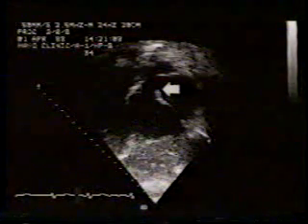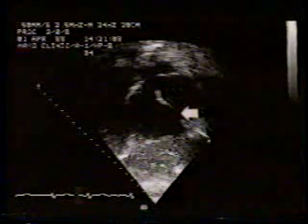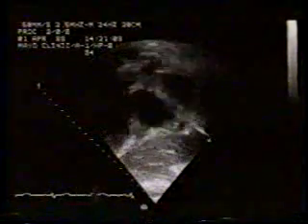We are looking at the crest of the atrial septum. Note clear visualization of this large sinus venosus ASD. The thin membrane of fossa ovalis is intact, and so is the lower portion of the atrial septum. Note in this position is the anomalous connection of right pulmonary vein joining the right atrium at the atriocaval junction. The defect is also clearly visualized in real time.